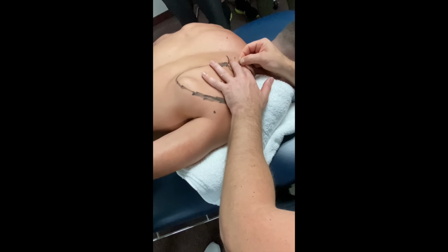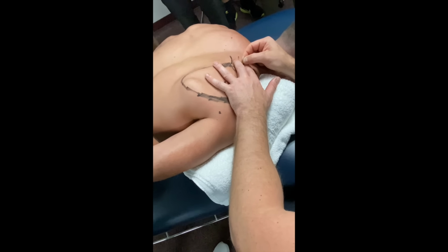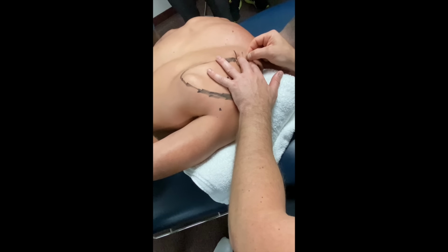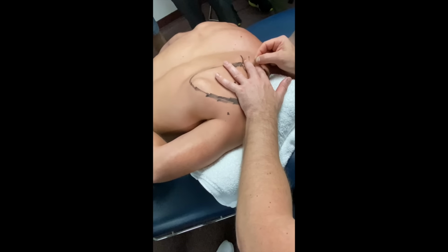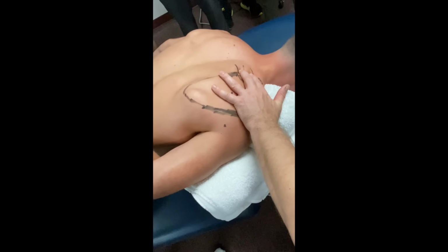Hitting the bullseye? Yeah. Problem: higher, lower? You think I'm in the right spot? Oh, you're on it. Okay. 10 to 15 seconds of some periosteal pecking. I'm hitting the bone every single time here, no question. Now, looks like I'm deep as hell there, right?